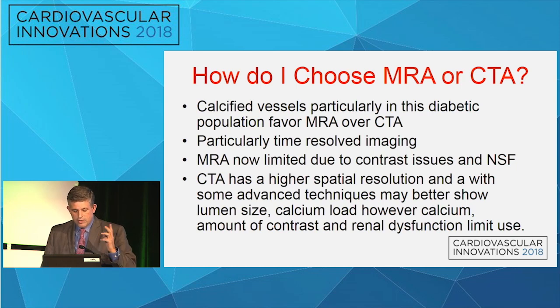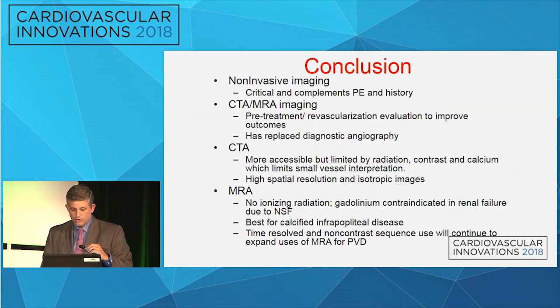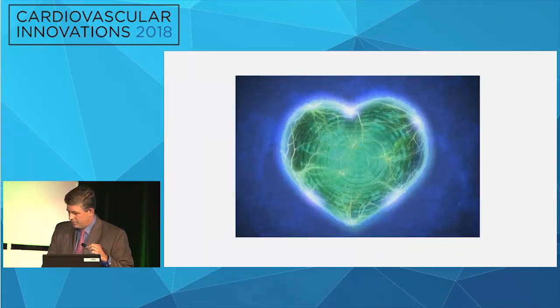So when do I choose? I think this is really a repetition. Calcified vessels, I prefer an MRA over CTA, particularly with time-resolved imaging, limited with contrast, but CTA does give me a higher spatial resolution. So with that, thank you very much for your time.